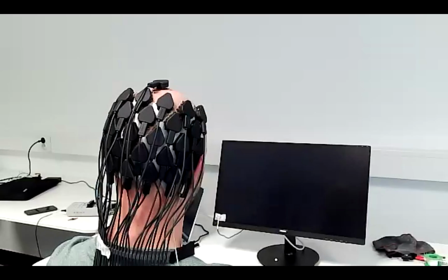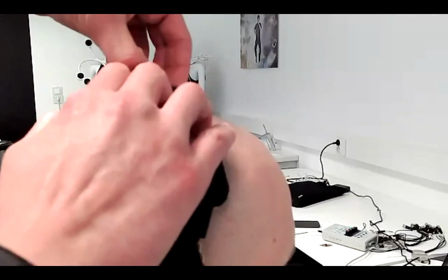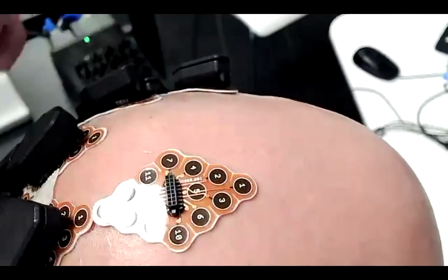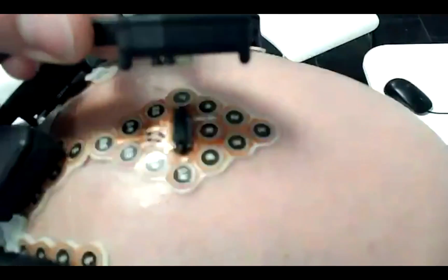Leo Side is asking to show the connector, how it's plugged into the head stage. Sure, I can do that. I will just plug it out now. Normally you do this at the end of the experiment, but if I film it from the top, you can see how the electrode is attached, and you see this connector with 16 channels. Number 1 needs to be in the front, of course.